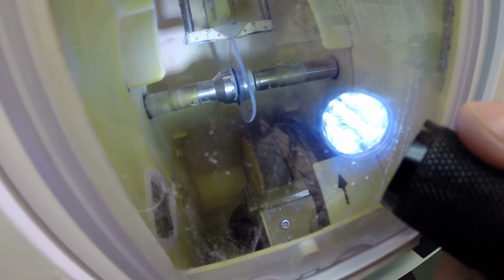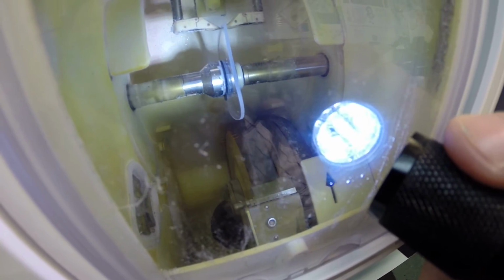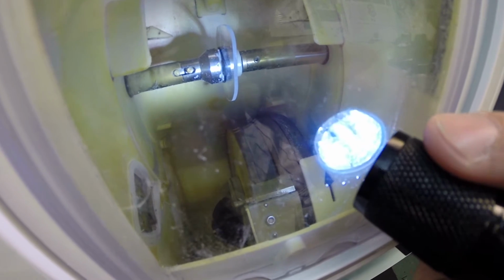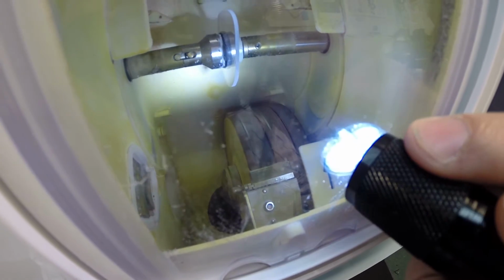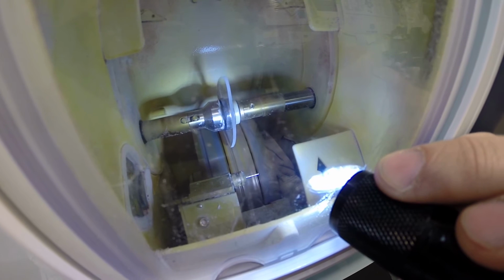Now it's doing its last little check and balance system to know again where to place the bevel. If you notice, your lens is completely flat around the edges, just like a nickel. If I were to take it out now, it would stand up on the counter on its own. But now it's going to drop down onto that middle wheel that has the bevel in it, that V bevel. And that's what's going to put the bevel onto the lens so it stays inside the bevel of the frame.